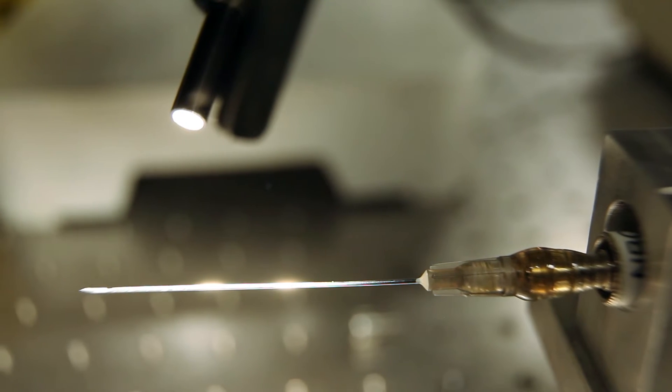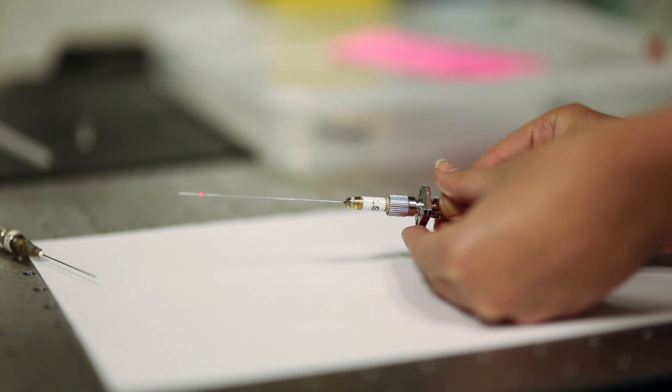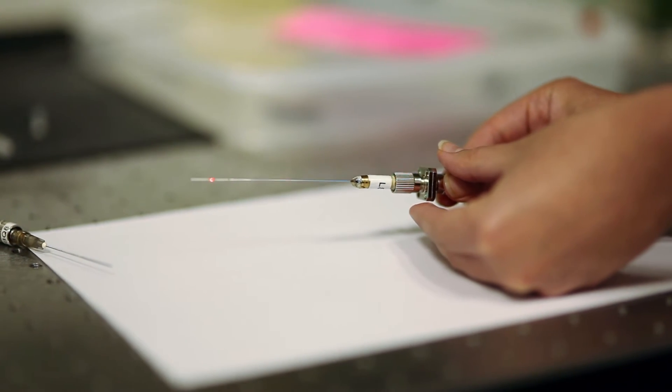One of the problems is light doesn't penetrate into the body very far, and that's why we've made this tiny probe that we can actually put in during surgery.